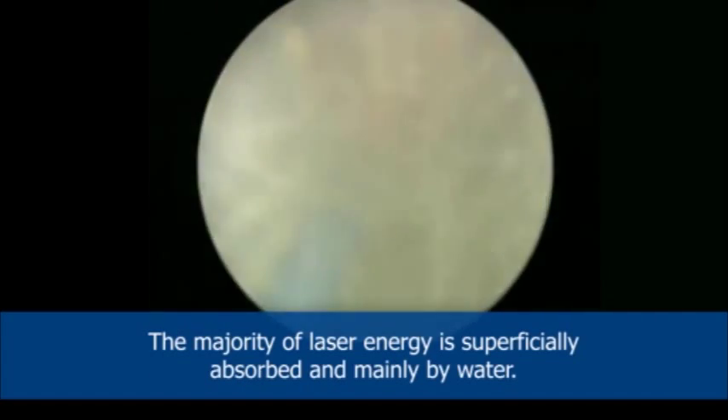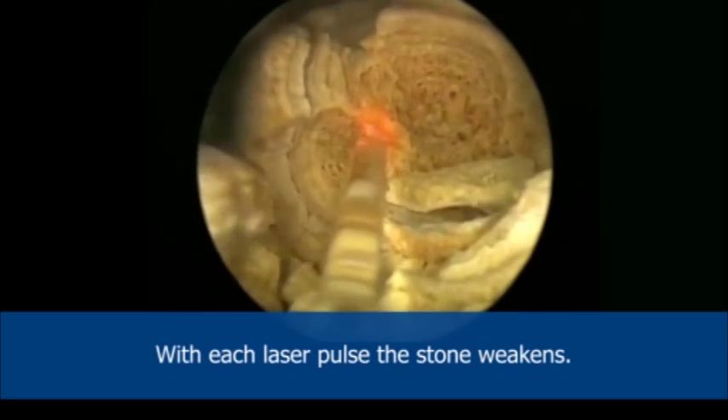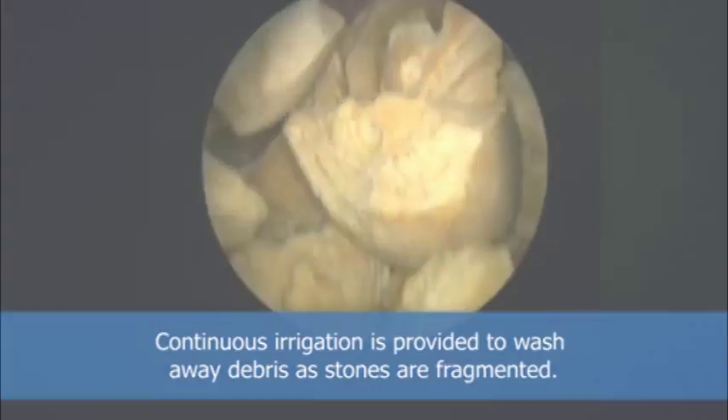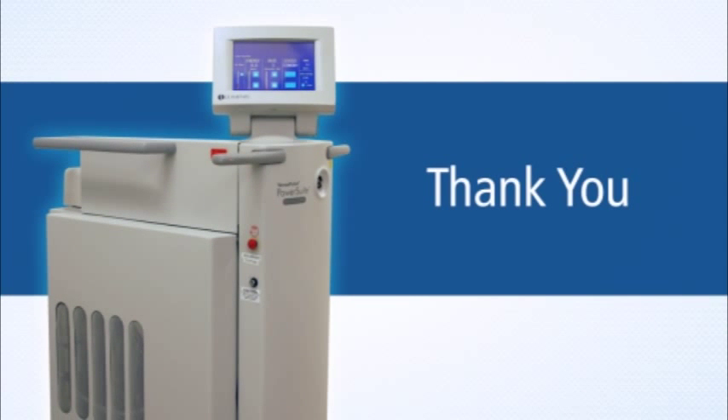The majority of laser energy is superficially absorbed, and mainly by water. With each laser pulse, the stone weakens. Continuous irrigation is provided to wash away debris as stones are fragmented. This has been an overview of how the Holmium works and its main safety features.